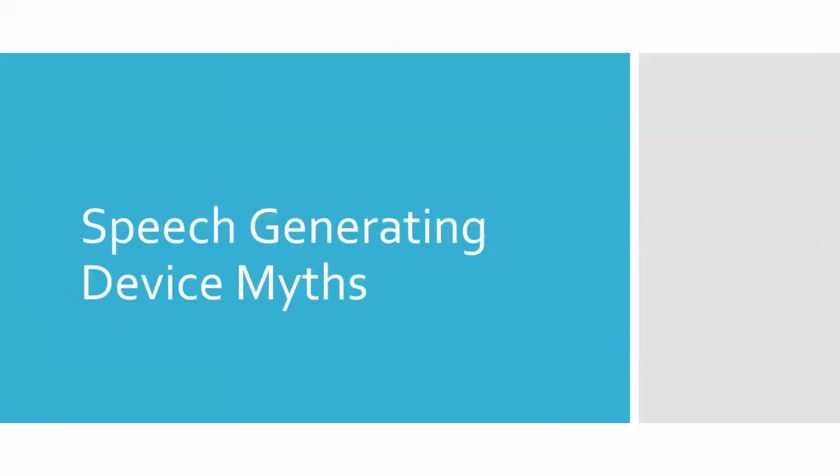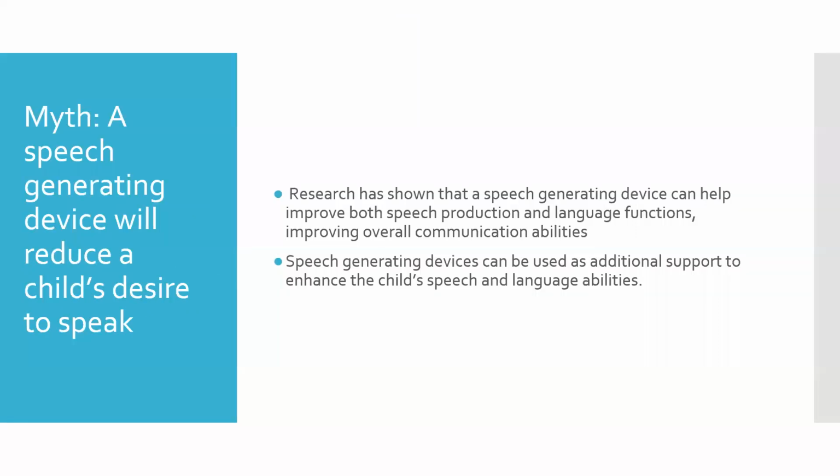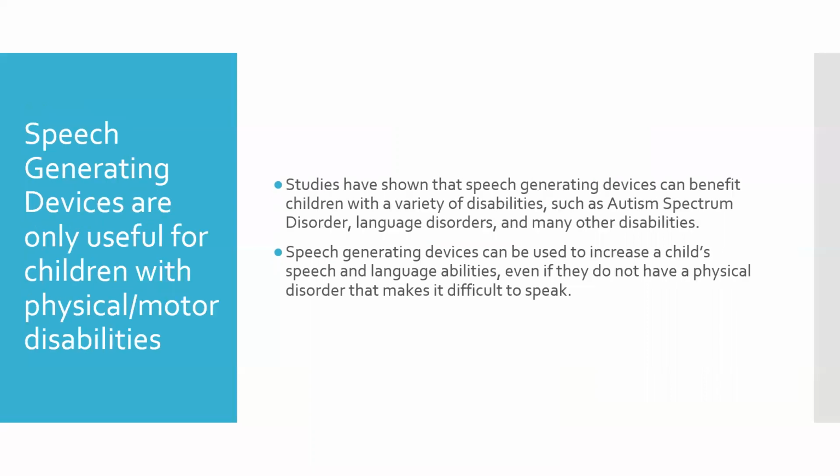For our final topic, we are going to be going over speech-generating device myths. So the first myth is that a speech-generating device will reduce a child's desire to speak. Research has shown that the opposite is actually true, and speech-generating devices can help improve both natural speech production and language functions, improving overall communication abilities. Speech-generating devices can be used as additional support to enhance the child's overall communication skills.